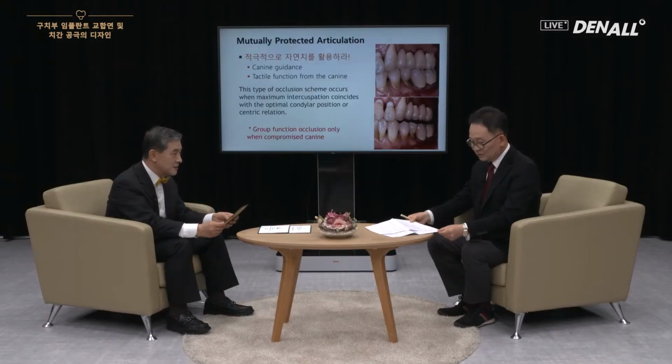One more thing. Regarding the embrasure space, designing it is not easy, and there is a difference between anterior and posterior regions. Aesthetics sometimes do not go hand in hand with function, which should be considered more important in terms of the embrasure space.